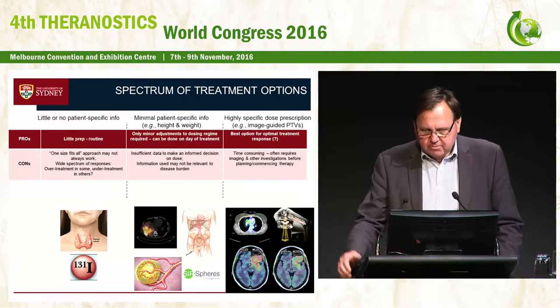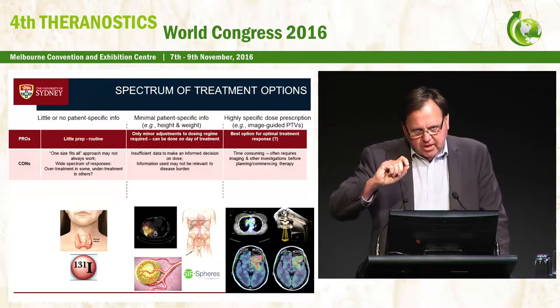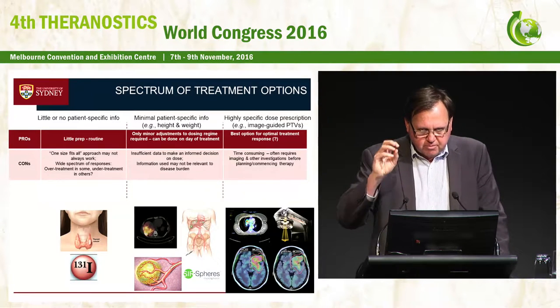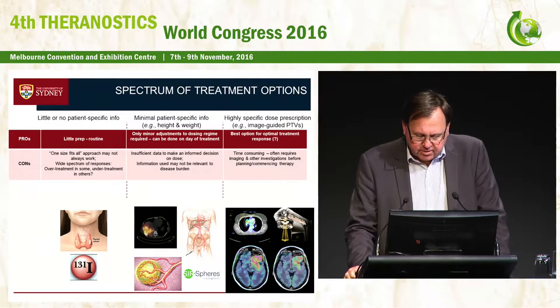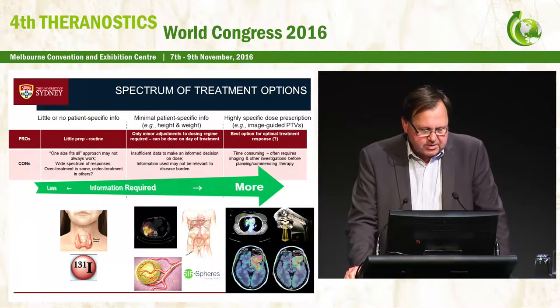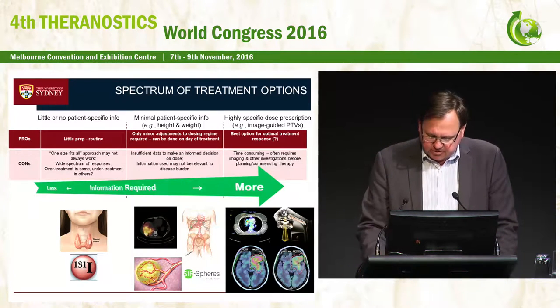And at the other end of the spectrum, as I say, what the radiation oncologists are doing today: time-consuming, precise definitions, dose painting, trying to get maximal doses to tumour, minimising splash dose in normal tissues, and even providing boost doses, often based on the functional images, as you can see here from FET PET scanning combined with the MRs. So it's clear that when you go from the less specific to the more specific, you need a lot more information, you need a lot more time, that's certainly for sure.